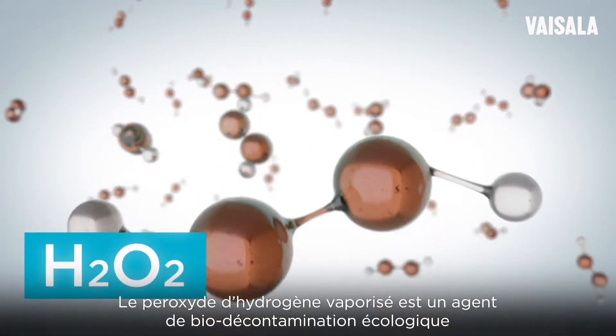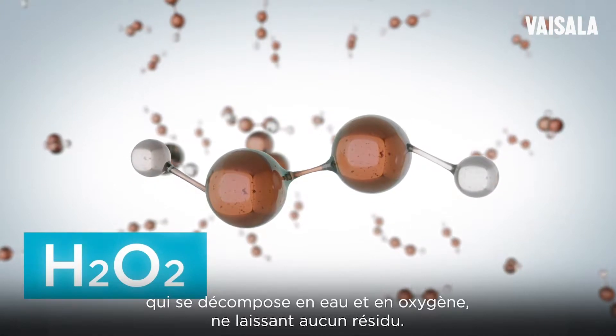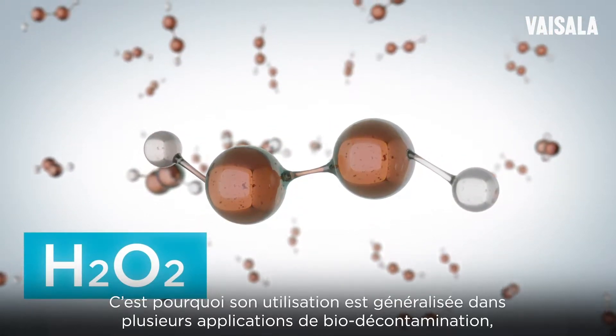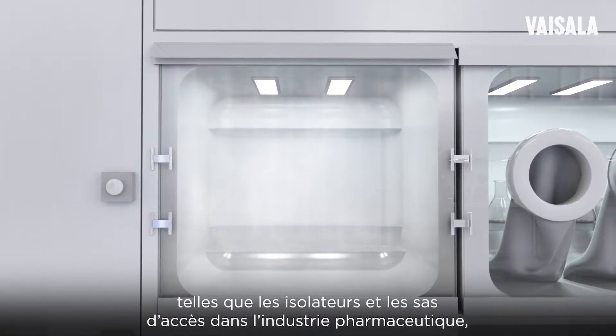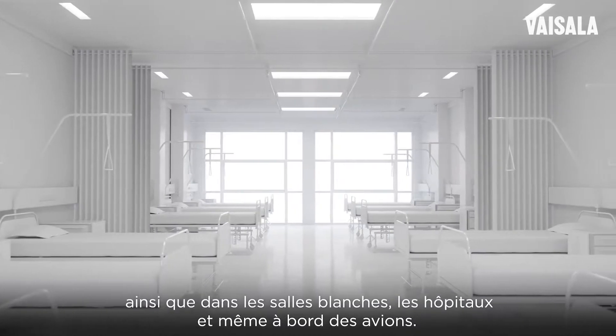Vaporized hydrogen peroxide is an ecological biodecontamination agent that decomposes into water and oxygen, leaving no residue. This has led to its widespread use in several biodecontamination applications such as isolators and transfer hatches in the pharmaceutical industry, as well as in clean rooms, hospitals, and even onboard aircraft.